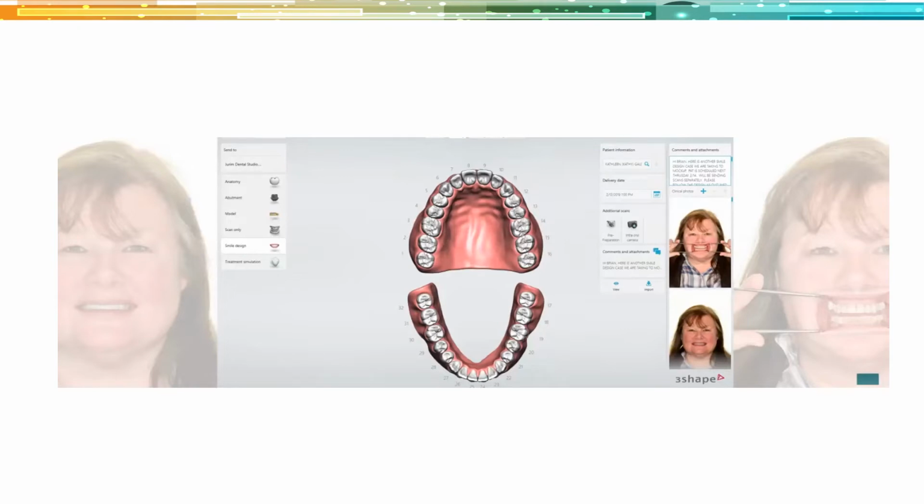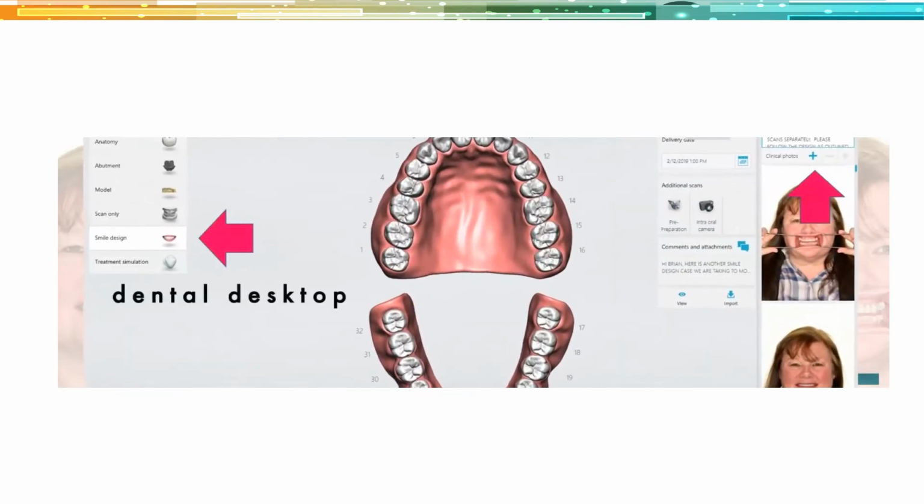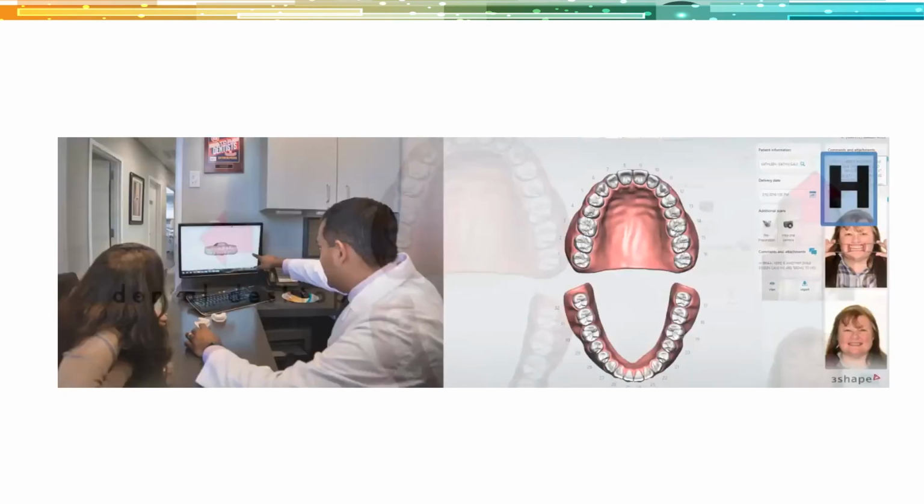And so when it comes to a smile design, we're not going to use the scan, we're only going to use those two photos. So I simply just click Smile Design on the left-hand part of the screen. And then where you see that little plus icon on the upper right, I'm just going to grab those two photos from the File Explorer. And then I'm going to invite the patient into my office. And so we do all of this live with the patient.